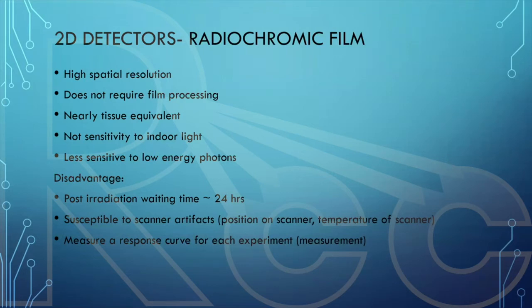Thank you. I do have one more quick question about films that was posted, regarding EBT3 film for extended SSD. Can we use it for TBI commissioning for cross-verification of data taken from the ionization chamber? Specifically, the follow-up was, due to high spatial resolution, they had faced noisy PDD data at extended SSD at about 500 cm. Is there a way to filter those noises? I don't have experience using film for TBI.